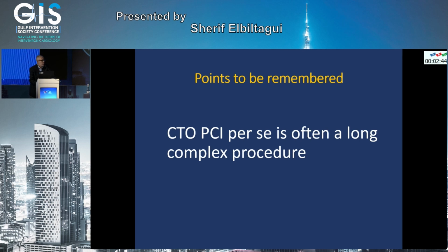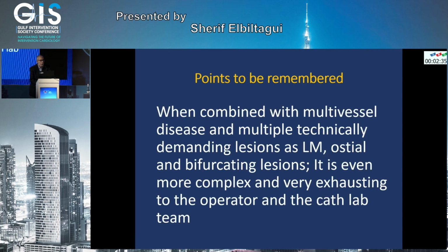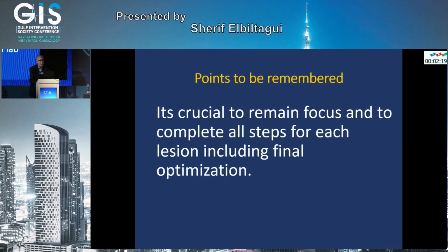So, Mr. Chairman, my message in this case is that CTO PCI per se is often a long, complex procedure. But when combined with multi-vessel disease and multiple technically demanding lesions, such as left main, ostial, and bifurcating lesions, it is even more complex and very exhausting to the operator and the cath lab team.